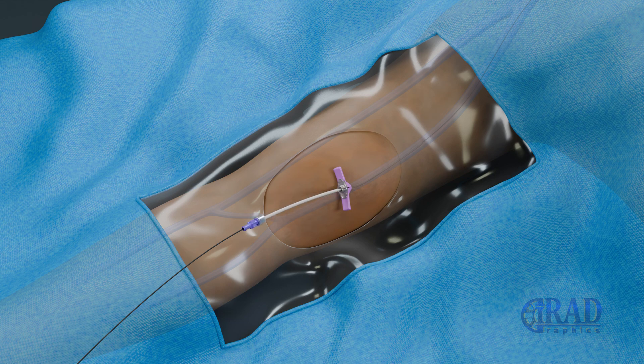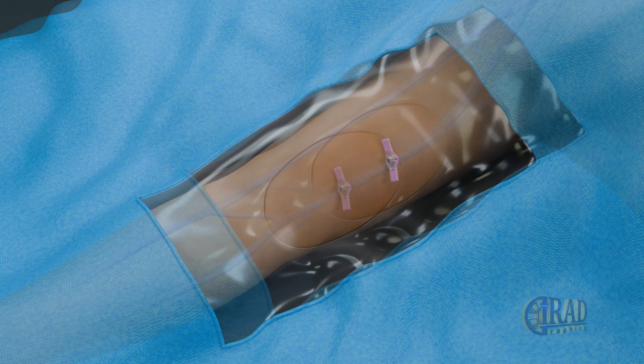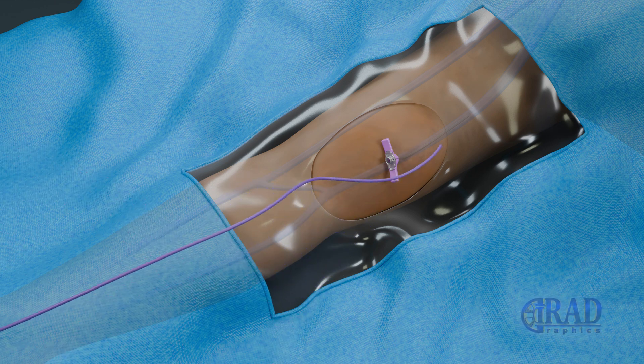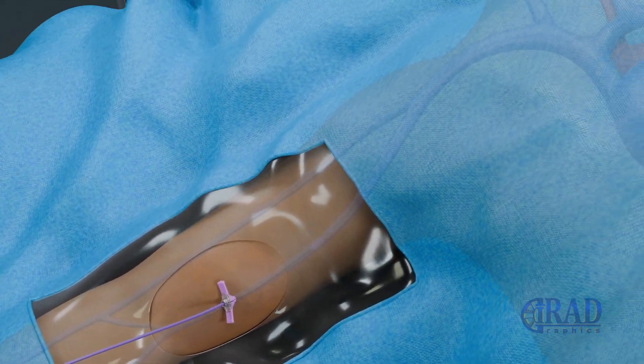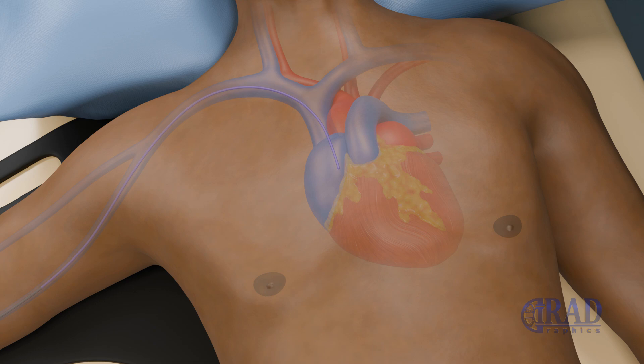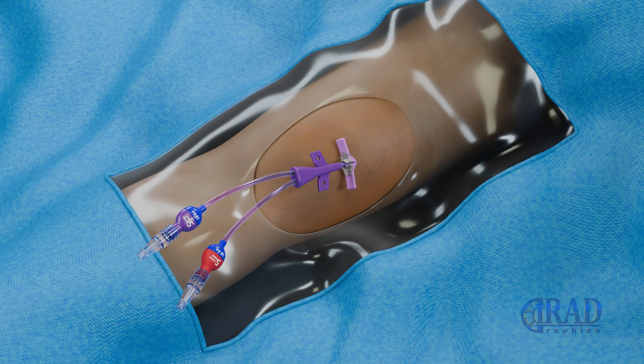The dilator of the peel-away sheath and the microwire is exchanged with the catheter, which is carefully advanced through the peel-away sheath into the vein until the tip is placed at the far superior vena cava or cavoatrial junction. Subsequently, the peel-away sheath is removed.